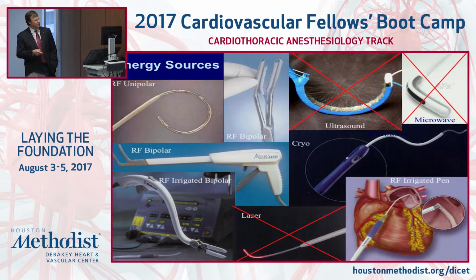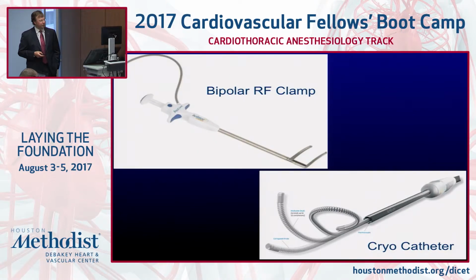So we have unipolar radiofrequency devices, we have bipolar radiofrequency devices. You're going to see both, the bipolar radiofrequency and the unipolar and the cryo procedure in the lab today. This is the cryoprobe. It can be done epicardially or endocardially. It works better endocardially. And again, bipolar clamp and the cryo catheter.